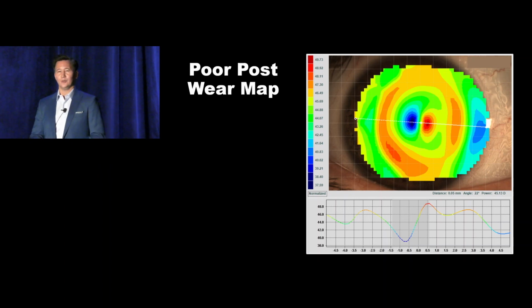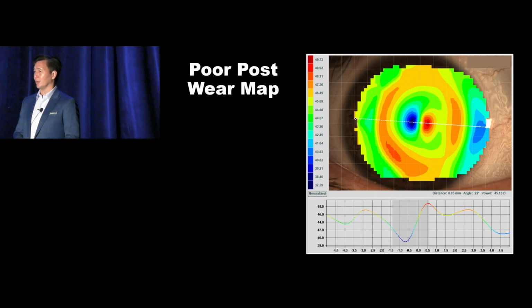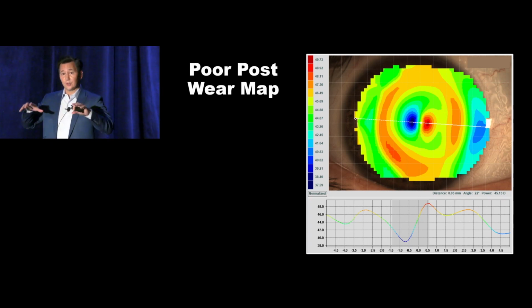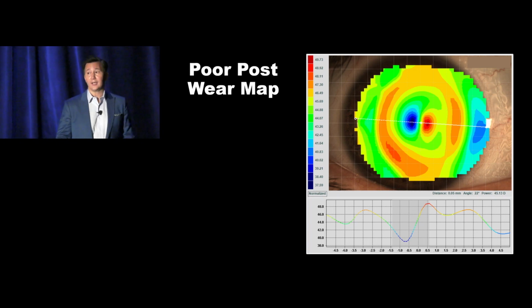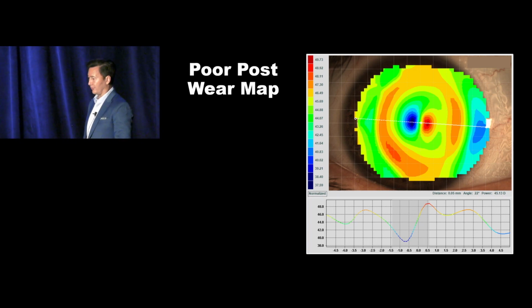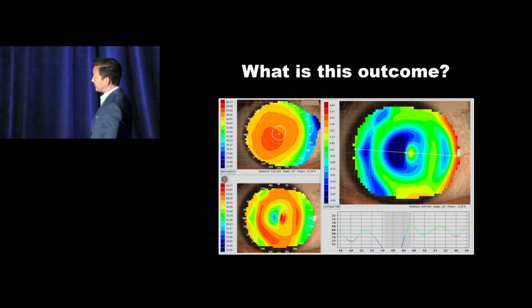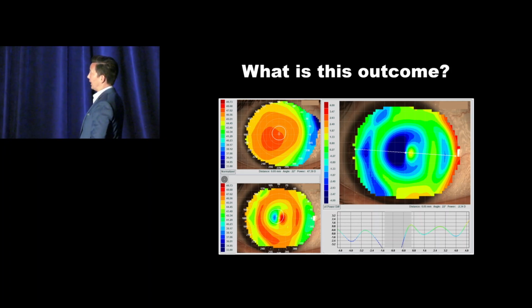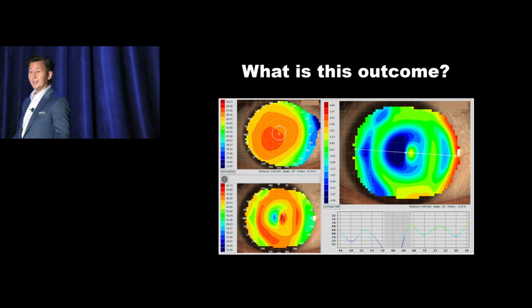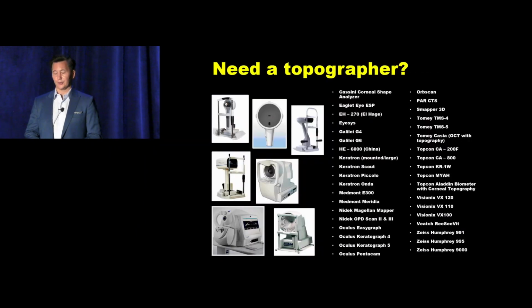That doesn't happen in normal eyes, and it doesn't happen after orthokeratology. Ortho-k uses that tear layer profile, that fluid layer, to create compression and suction on the surface of the eye. We don't get these massive shifts in the curve or elevation of the eye. So this is an utterly poor topography. And if we put it into a subtraction, you see that it appears to be a bullseye. The blue treatment zone is kind of well centered to the pupil and the visual axis, but there's this island. Is that real or is it false? So again, we have to be critical of our captures.